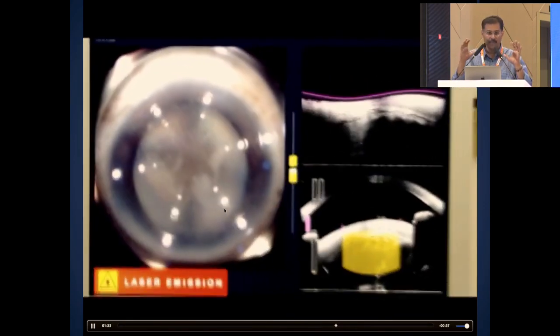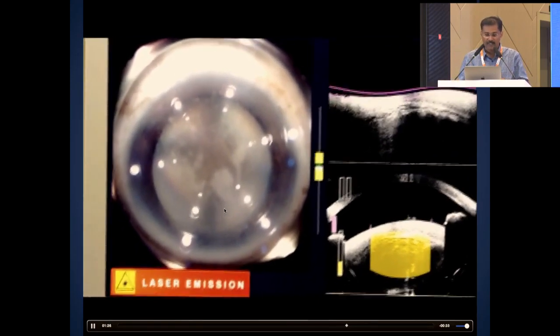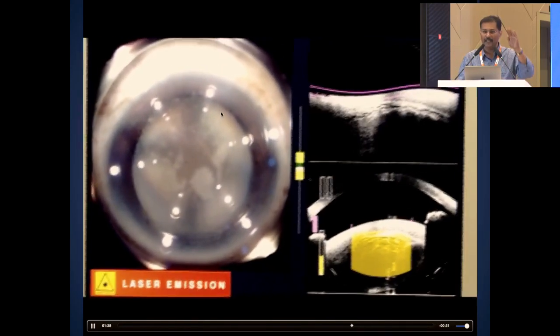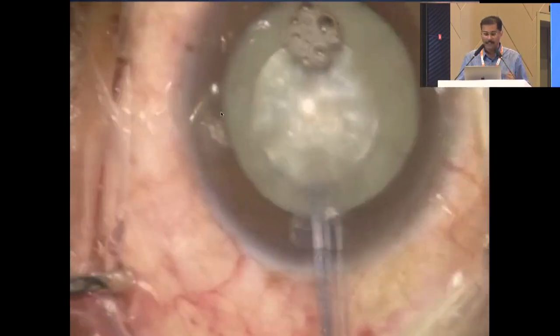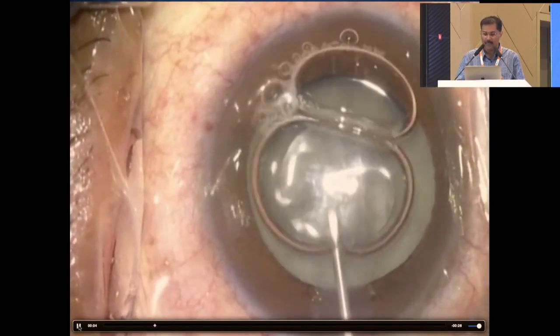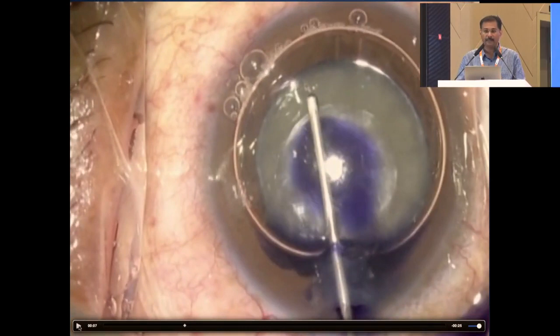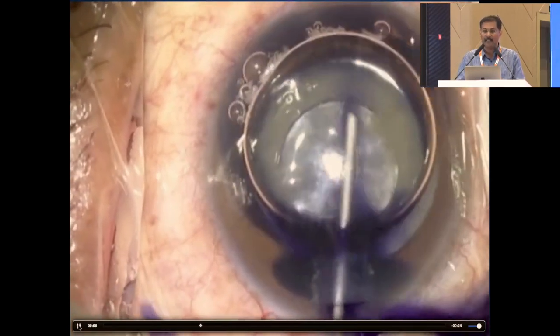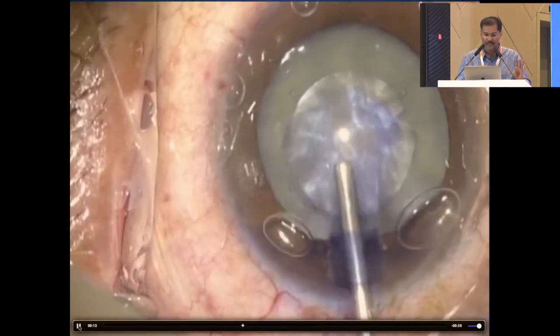It doesn't cross through gross arcus or a mature cataract, it doesn't pierce, but then still whatever is available you'll get, but then the level of the cataract capsule again changes, so you may get it very much incomplete. So once I have a mature cataract or a hypermature cataract or intumescent cataract, I always put stain. Once I stain, I know where the anterior capsule is and whether it is moving freely or there are attachments. So many times there will be attachments.